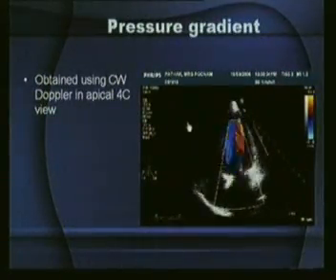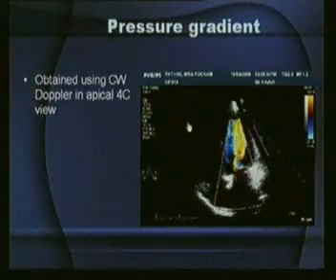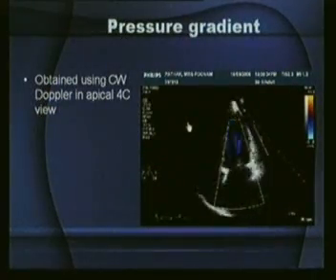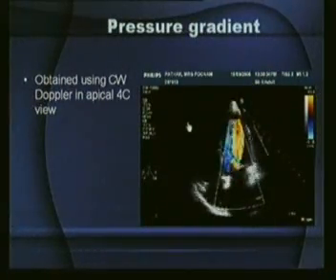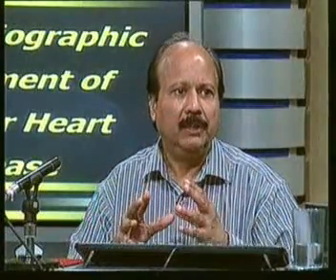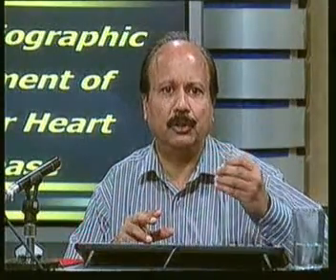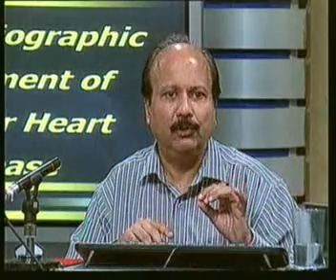When you are looking at a patient with a stenotic lesion, be it MS or AS or PS or TS, two or three things are common. You will want to know the gradient across the valve and the area of the valve. In these two measures, echocardiography stands alone. There is nothing which can give you these two measures within 20 minutes of the application of a transducer on the patient's chest in the left lateral position. You will know the entire sequence of events. You will know the entire diagnosis.